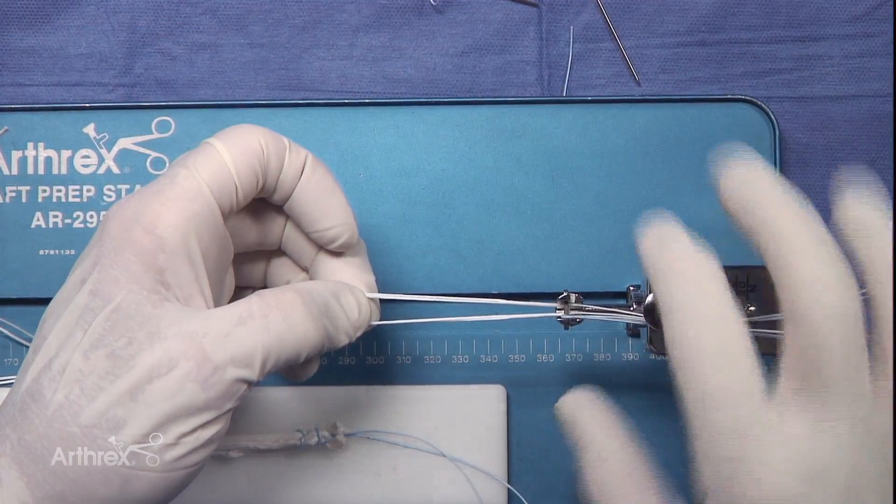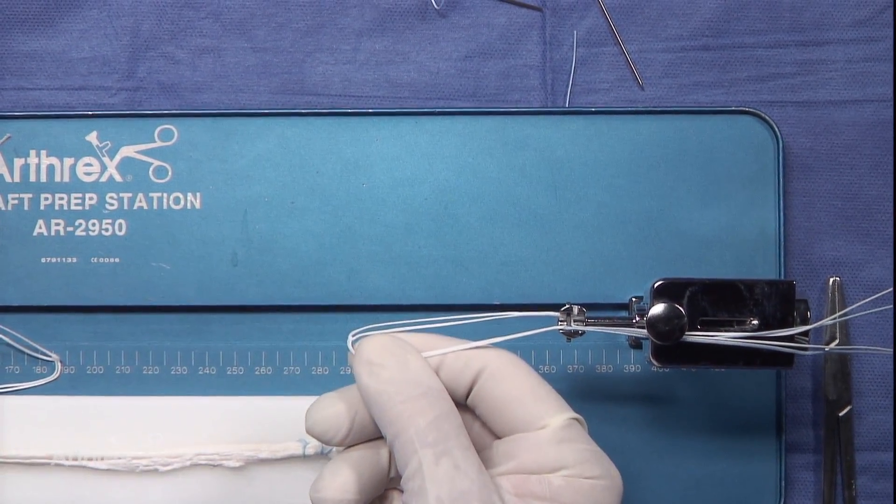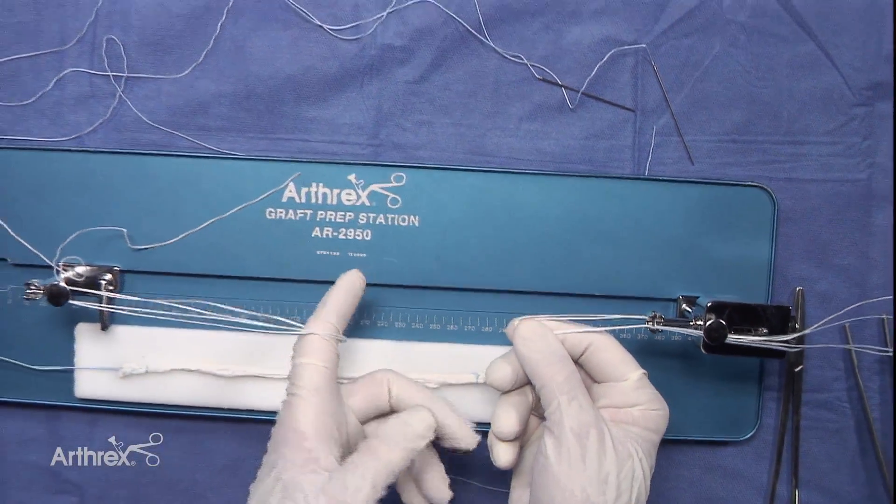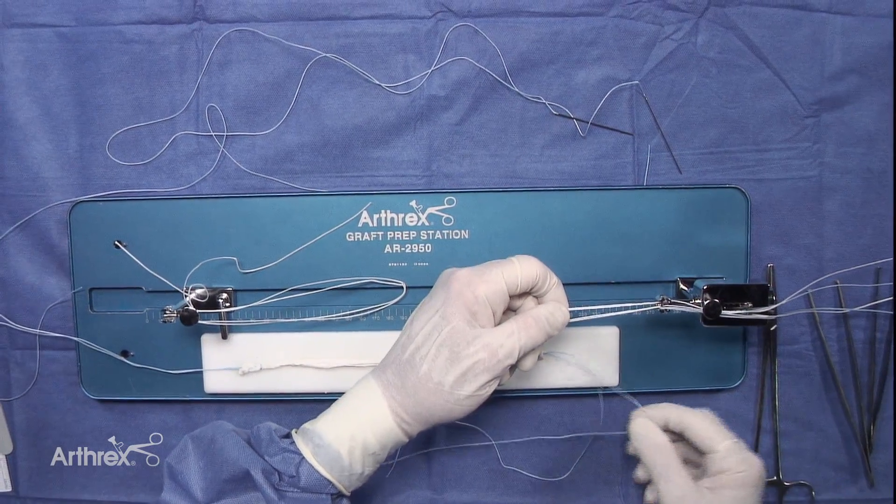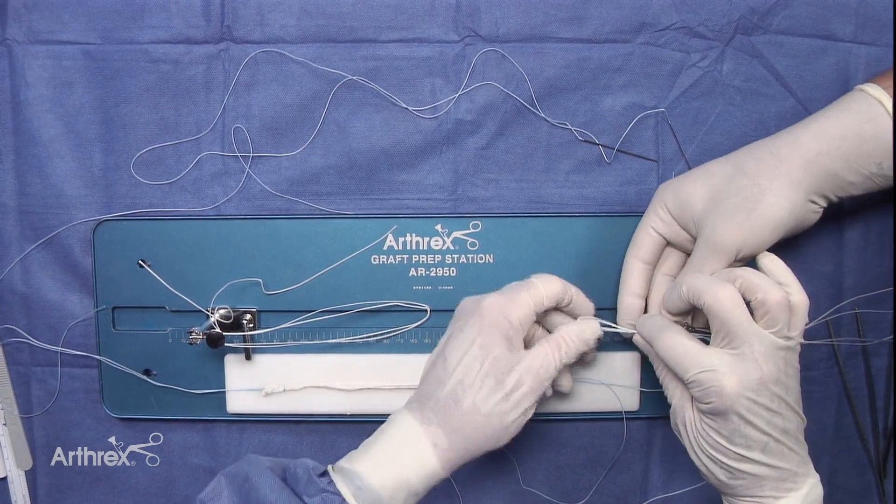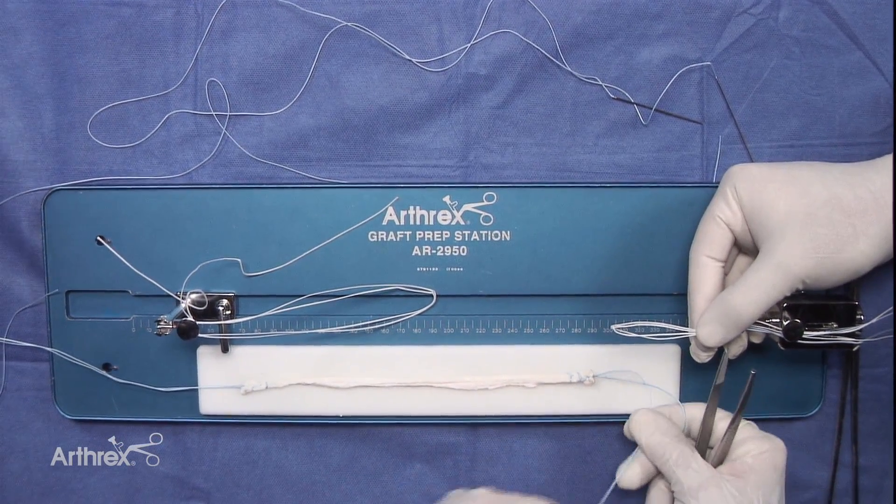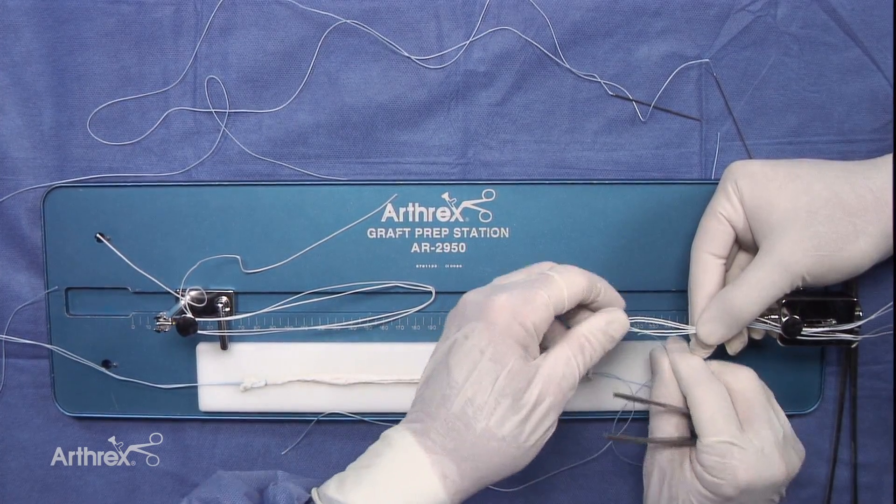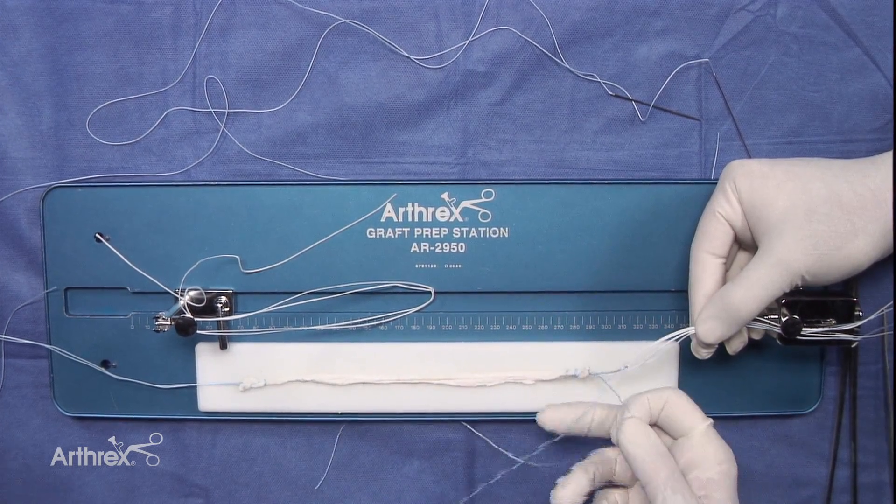This shows the tightrope attached on one side, and we have the tightrope, the ABS tightrope on the other side, and very simply we're going to pass the graft through a triple loop. The first passage, you have to have good management because you have eventually six strands that you're dealing with, but very simply we're going to pass one end through and tie it to that end.